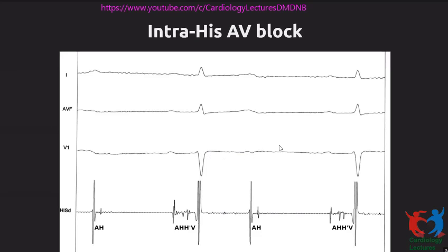Here you have a P wave not conducted to the QRS. Here again, we have a P wave and it's conducted to the QRS. So the question here is, did this block in the node that is above the his or below the his? Because we are recording a his electrogram, if you see a his electrogram and then block, that means it blocks below the level of the his. Whereas if you do not see a his electrogram, it blocks above the level of the his. So that's as simple as it can be.